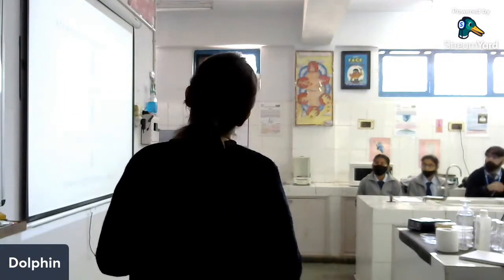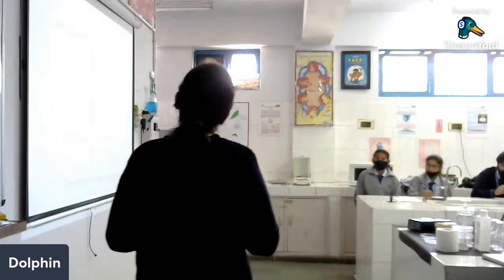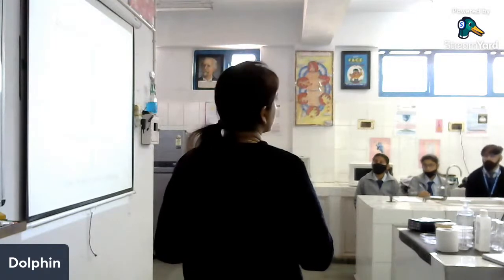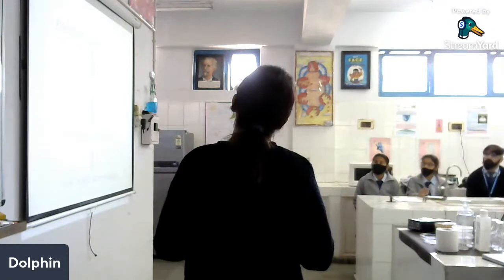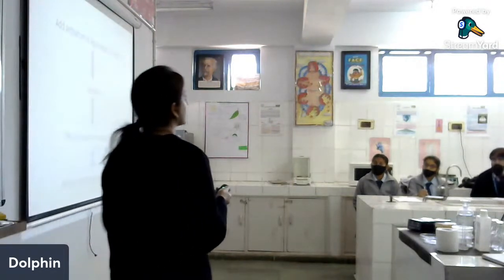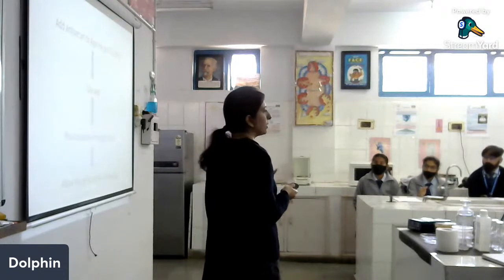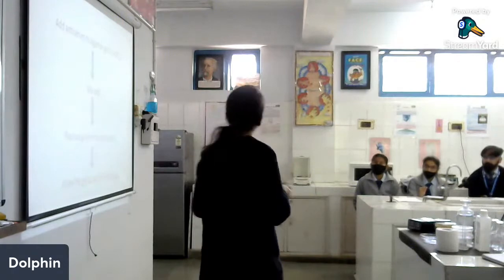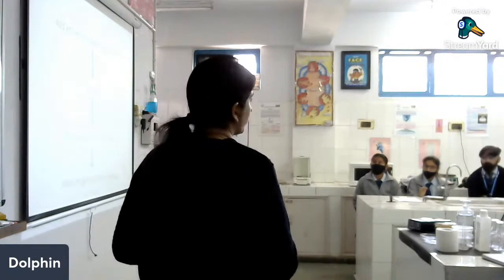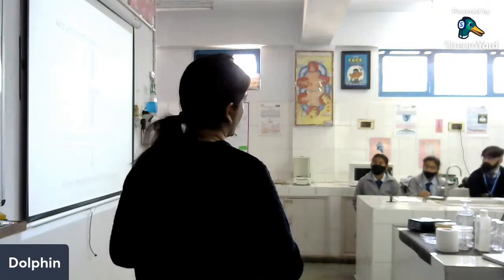What we will do today is we will first prepare the agarose gel. What is important is this gel, I'll give you the protocol. Just to understand, we'll prepare the agarose gel and we'll not add the antiserum. Antiserum means the antibody solution that we have. We will not add it if the temperature is above 60 degrees Celsius. That might inactivate the antibody. These are protein molecules. Protein gets inactivated above 60. So, logically, you should go below 60. Not much below, because it's a semi-solid medium, it will start to solidify, and then your antiserum will not mix homogeneously in the gel. So we keep the temperature approximately around 55 to 60. Your antiserum, you mix it into the gel and then you pour it on a glass plate which should be clean.